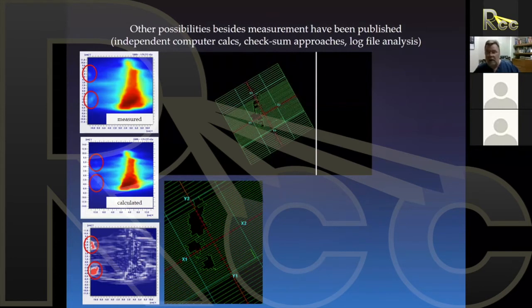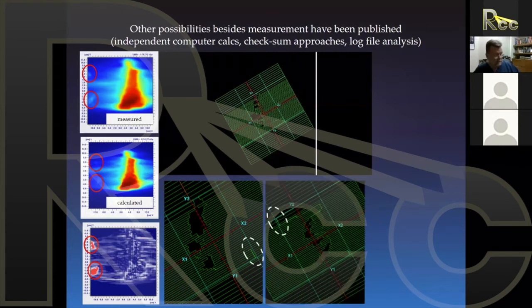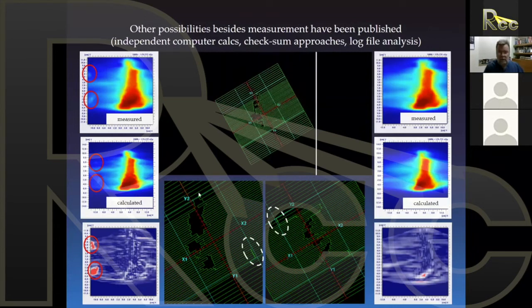If this was a log file approach where you simply deliver and the log file says, yes, I'm in agreement or disagreement with what the planning system said, this may not have been caught because everything would have said, yes, it was clearly here in the planning section or aspect. I would have just skipped right over this because everything would have been approved. So it is nice. It is arduous to do this work, but it is nice to find errors and to avoid them.